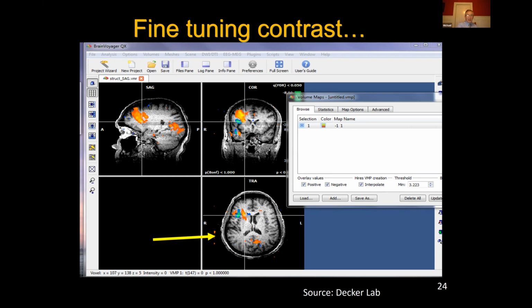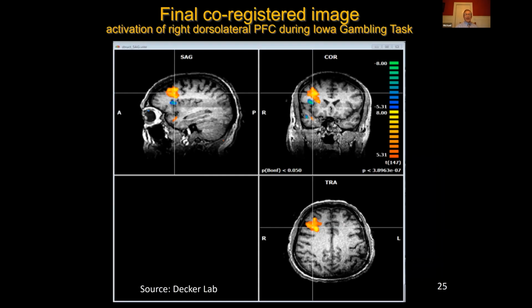But if you look out at the bottom right, you can still see that there's some fMRI related data outside the brain. So I put that in there to kind of say these techniques are good, but when you read the data, you look at the fMRI, there's a lot of user input and user interpretation as to what we think we're really seeing with fMRI. But once we clean up the data and we're able to tighten it up and get rid of all the noise, we do end up with something that's usable and tends to be repeatable.